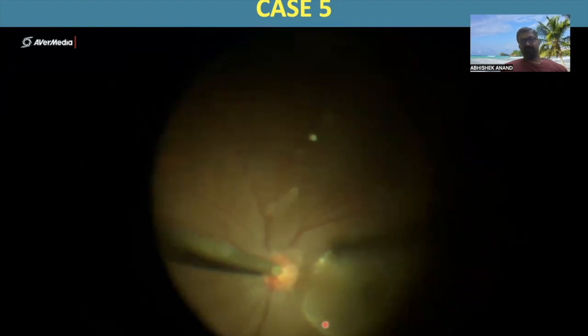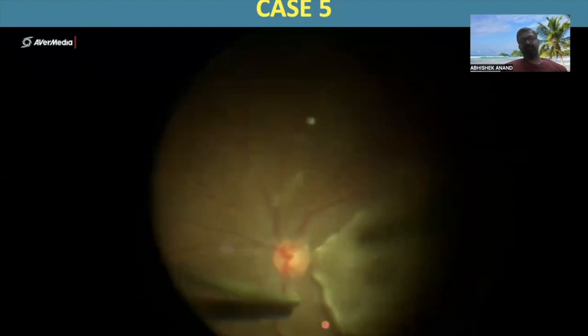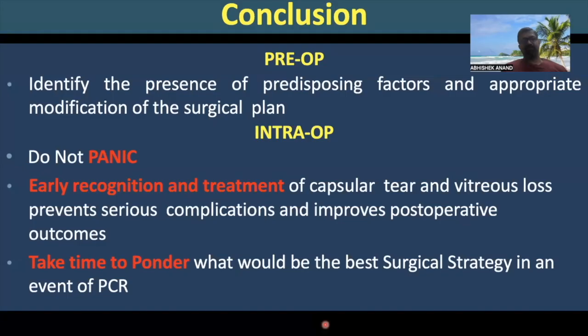And once the dropped hemi-nucleus is removed, one of the very important steps as a retina surgeon is staining of the cortical vitreous. Once we have stained and looked for the cortical vitreous, we do a complete posterior vitreous detachment with a complete removal of the vitreous.